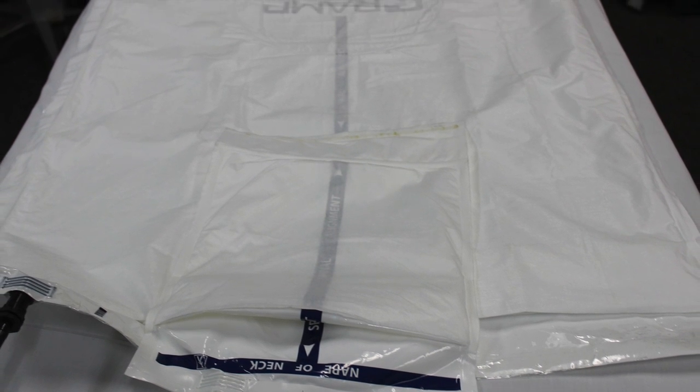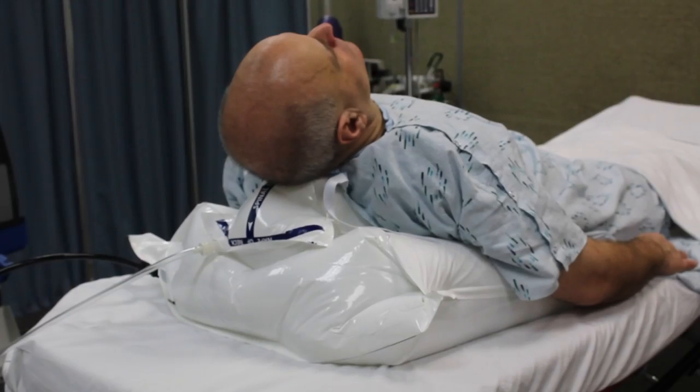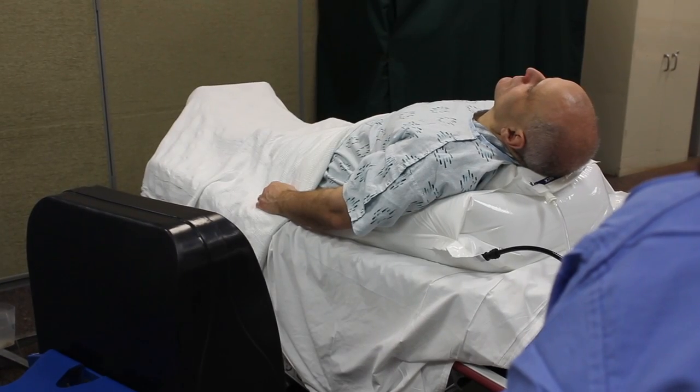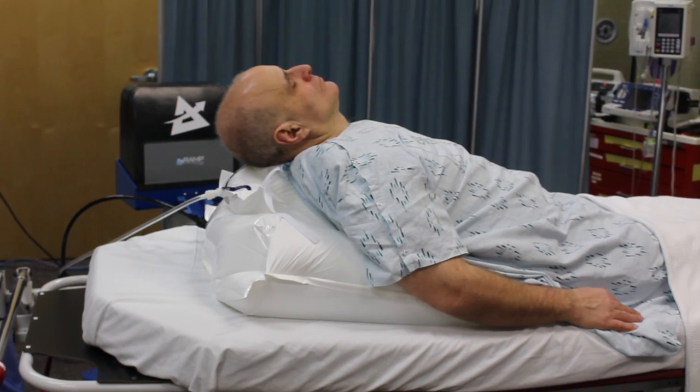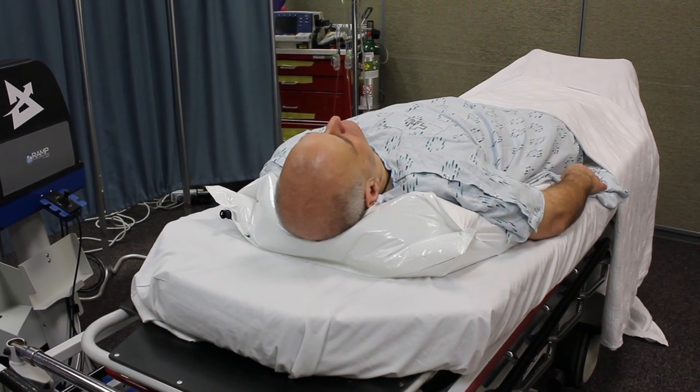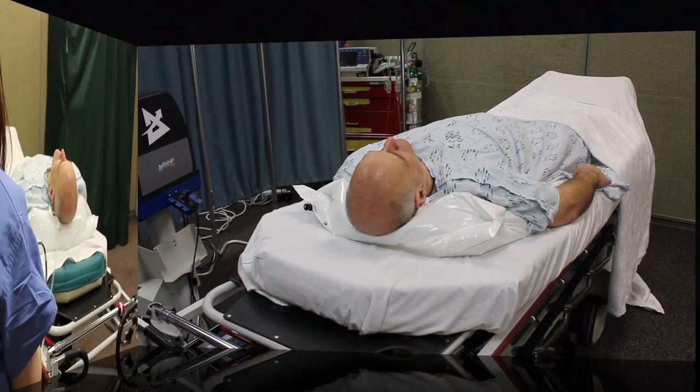Positioning the patient's midline along the spinal alignment indicator will also help to prevent rolling once the device is inflated. If at any point the patient appears to be uncentered or unstable, immediately deflate the ramp device and reposition the patient in accordance with the instructions above.